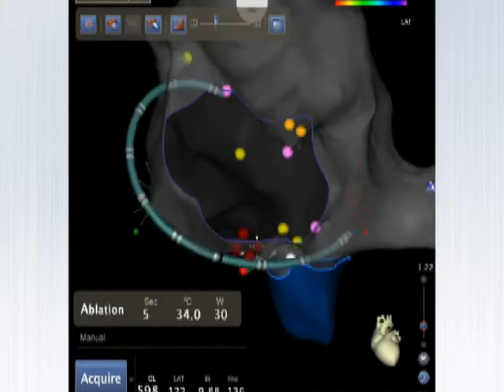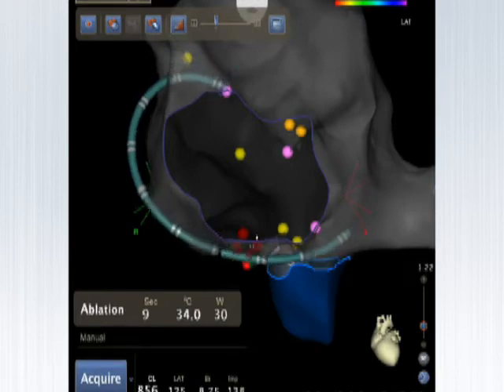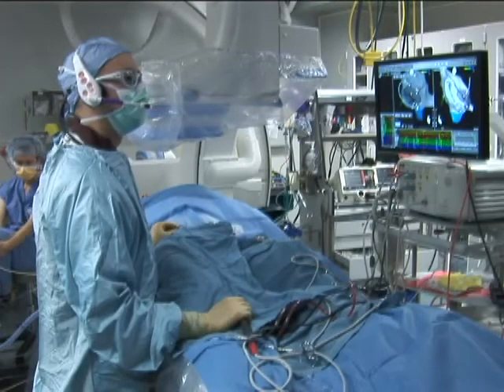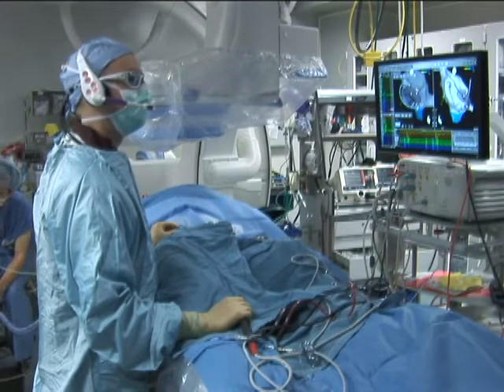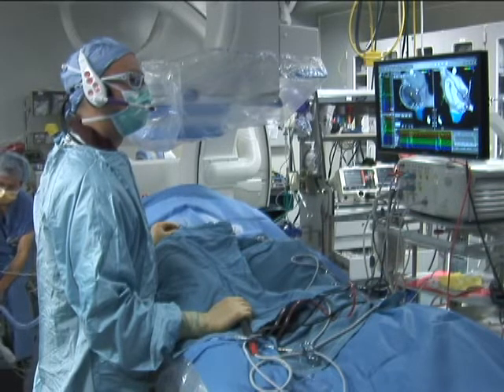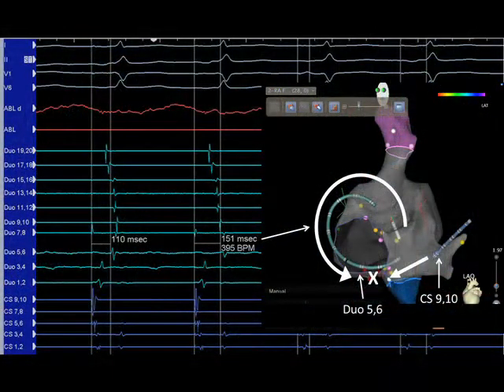The catheter is kept in position for 30 to 60 seconds, and a reduction in the atrial electrogram amplitude is seen. The ablation catheter is then pulled back a small amount until a new atrial electrogram signal is seen. This process is repeated until the inferior vena cava is reached or a line of block is seen. Several maneuvers are possible to ensure the ablation has created a complete line of block.